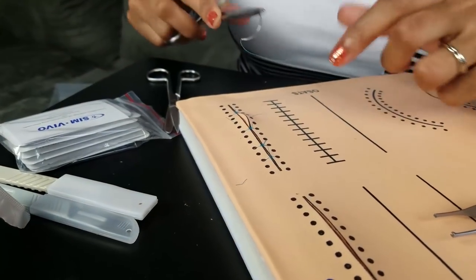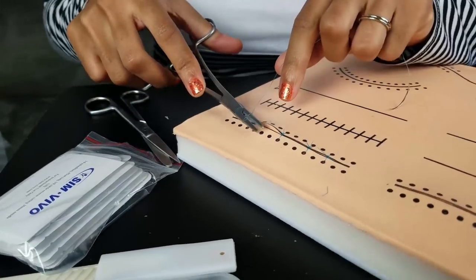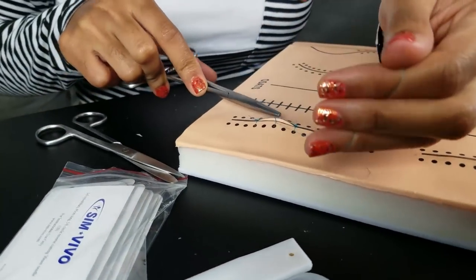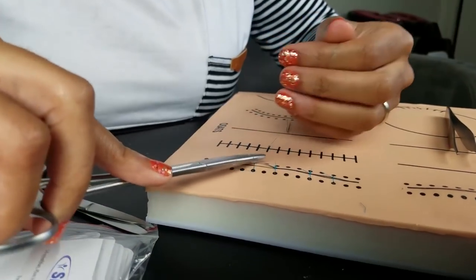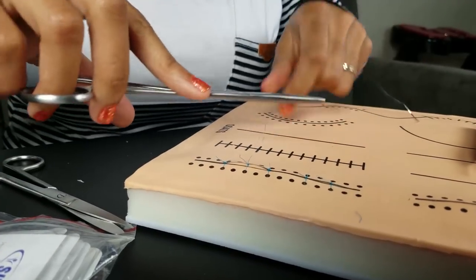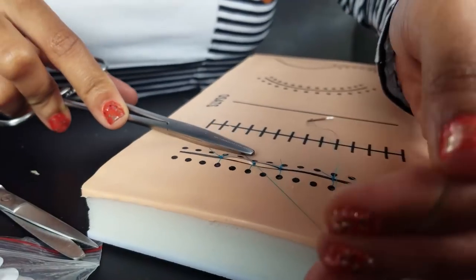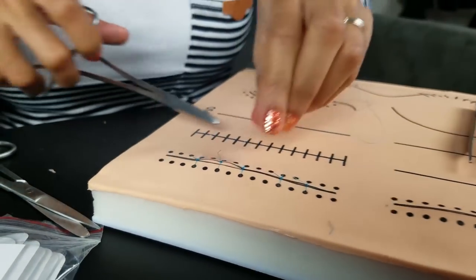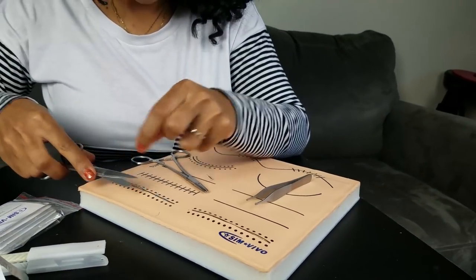Pull it through. Obviously, as I continue to practice and have more lessons like in school, as I said, I only did this one time before, I'll get better at this and I'll learn how to better do these different stitches and not waste any thread. But I think I'm doing a fairly decent job.